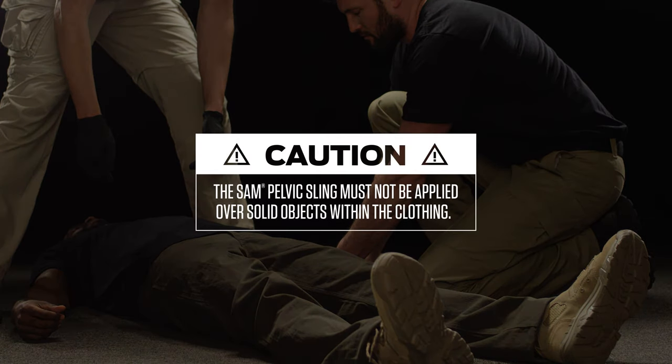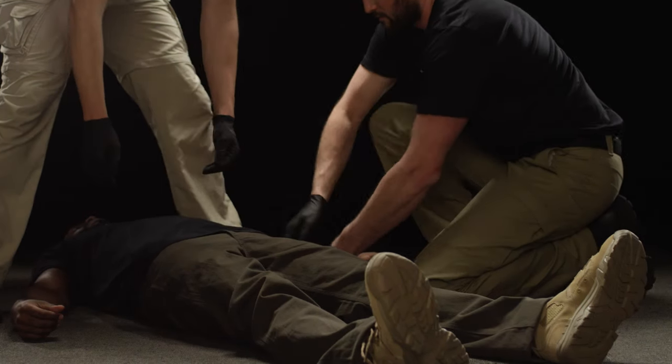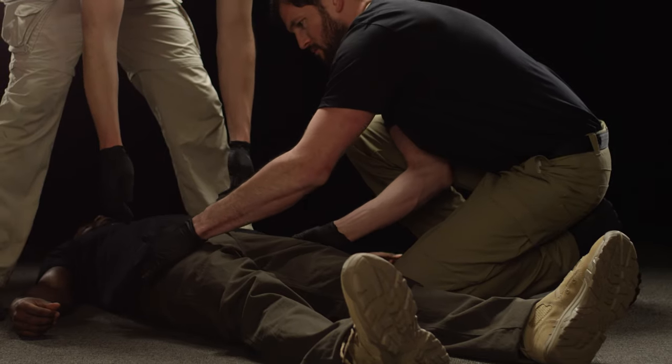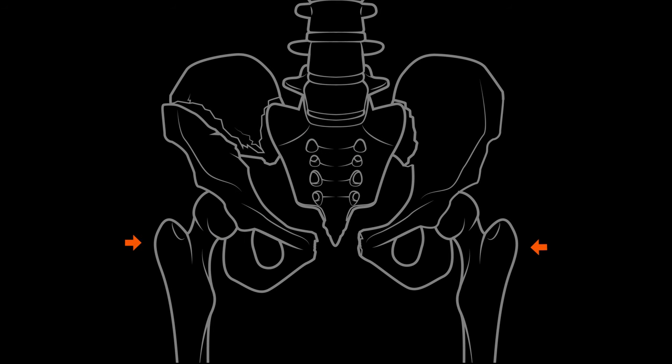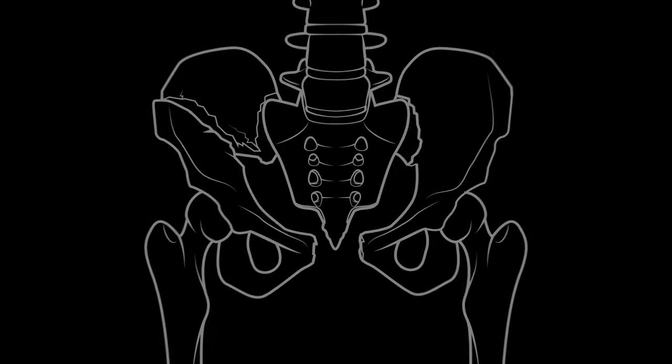If applied over a garment, be sure to remove any solid, sharp, or potentially obstructive objects on or inside the clothing. Locate the bony prominences on the side of the hips, the greater trochanters, where SAM Pelvic Sling should be applied.